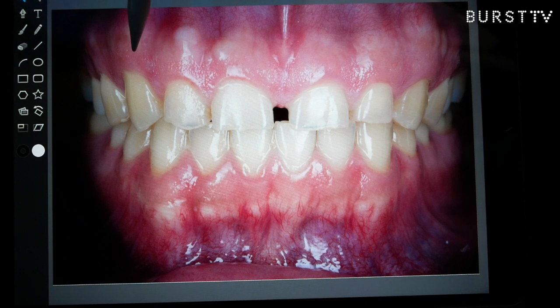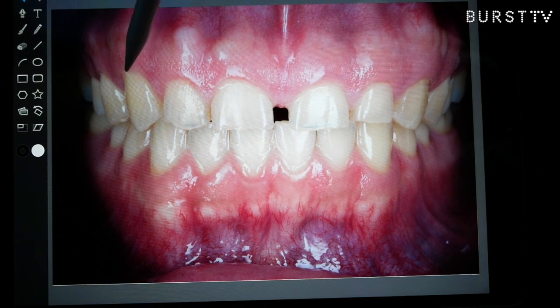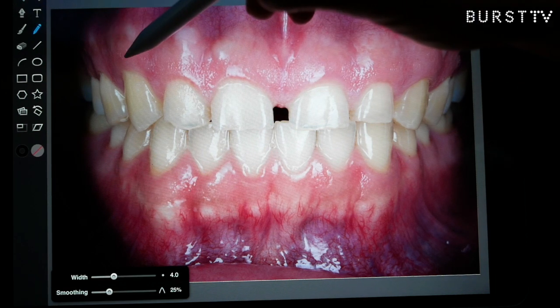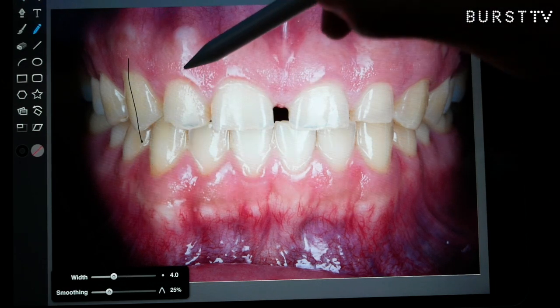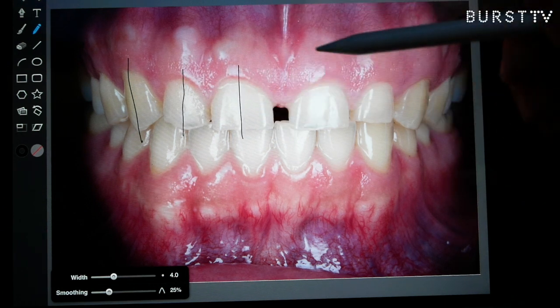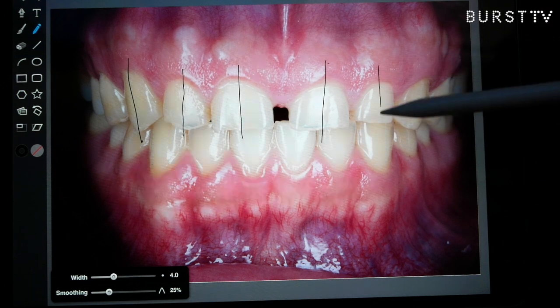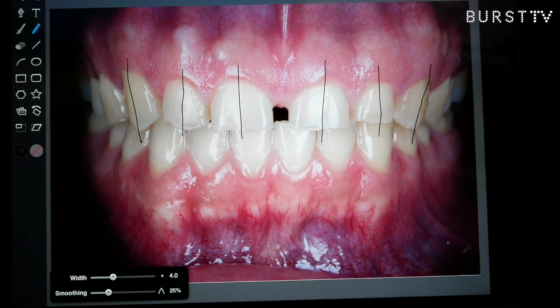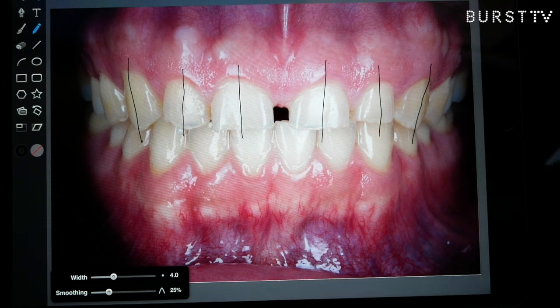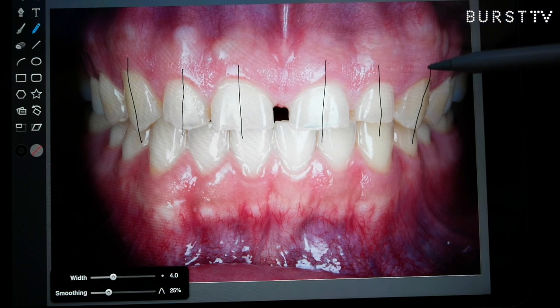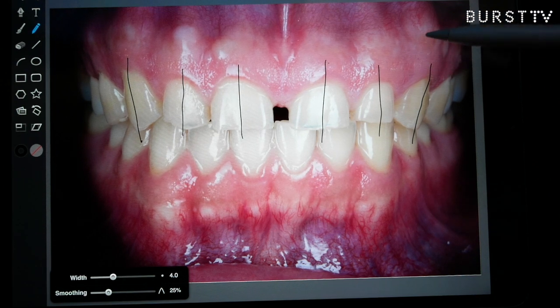First thing that I look at are the angles. Let's look at the teeth — let's draw some lines through our teeth. See the angles here, the line angles of the teeth? It gives me an idea of how the teeth are angled for his smile.